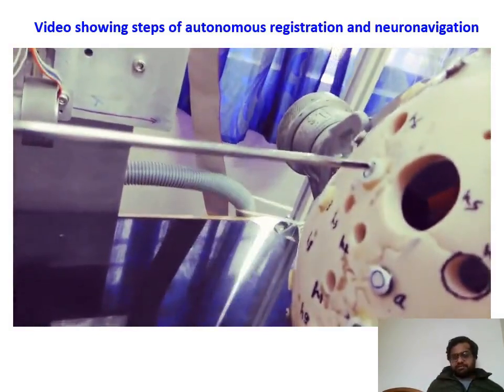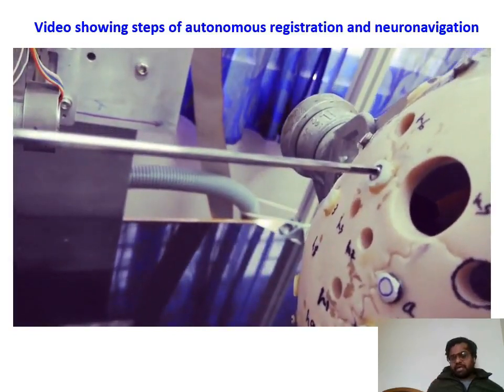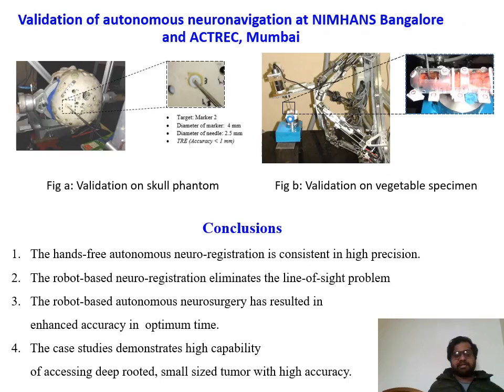Now it's time to validate, to see how exactly it's moving towards the target. As you can see, it has moved. I have validated autonomous neuro-registration at the National Institute of Mental Health and Neurosciences, Bangalore, and ACTREC, Mumbai. I validated on various phantoms and vegetable specimens. I took the scan of the phantom, placed the phantom in several different poses, and measured the coordinates using the algorithm I developed. Then I tried to relocate the target using the developed method, and I found that in every phantom the accuracy is within 1 mm.